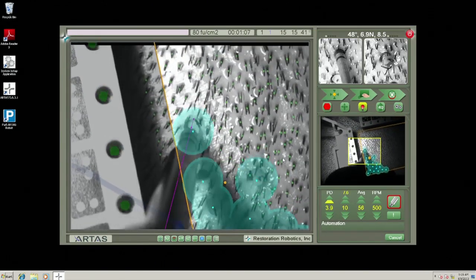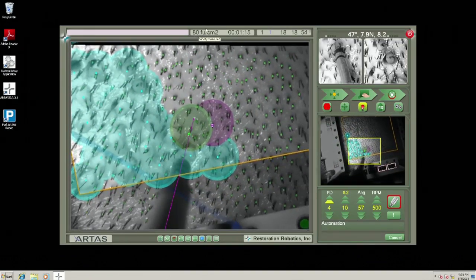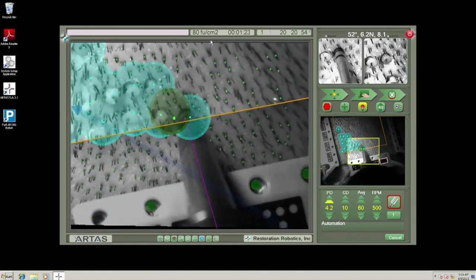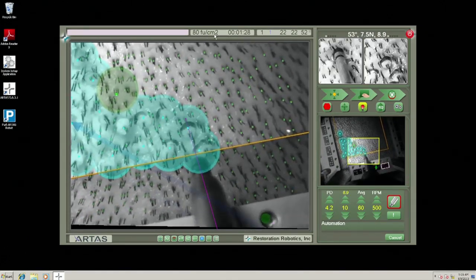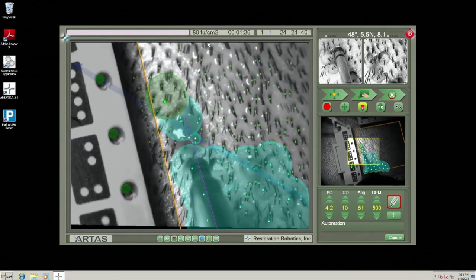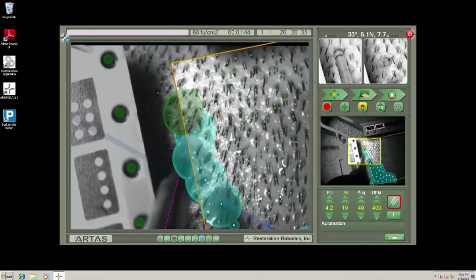What we try to do is figure out a parameter based on his predicted density, and we see up here 80 follicular units at the top of your screen, right in the middle. You'll see right at the top you have a digital readout of the density of the grafts, and this tells you basically how many grafts you should be able to take without getting into a moth-eaten appearance in the back. So it gives us guidelines on how aggressive we can be. Obviously, we don't want to take. Sure, go ahead.